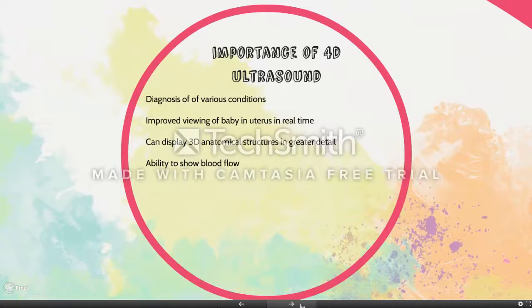Well, 4D ultrasound is important for the diagnosis of various conditions such as abnormalities of the uterus, location of cysts, and investigation of miscarriages. It also allows for better viewing of the baby's motion and behavior, the surface anatomy of the baby, and any problems related to a woman's uterus and ovaries. All of these things are better viewed on a 4D ultrasound machine than the traditional 2D machines.